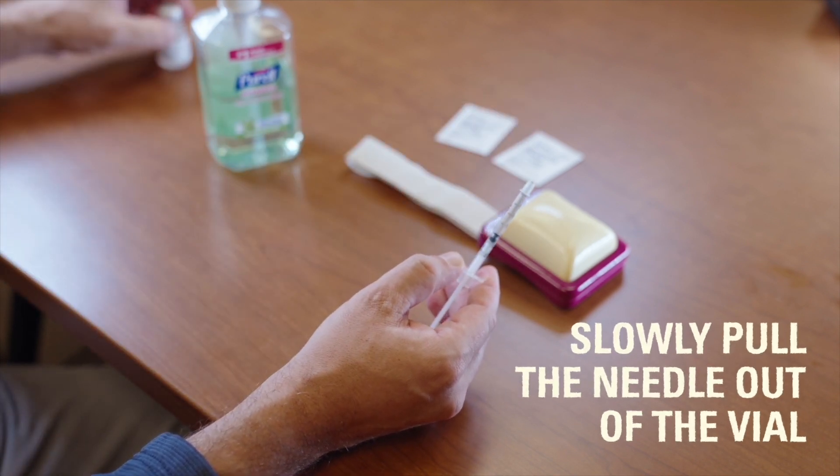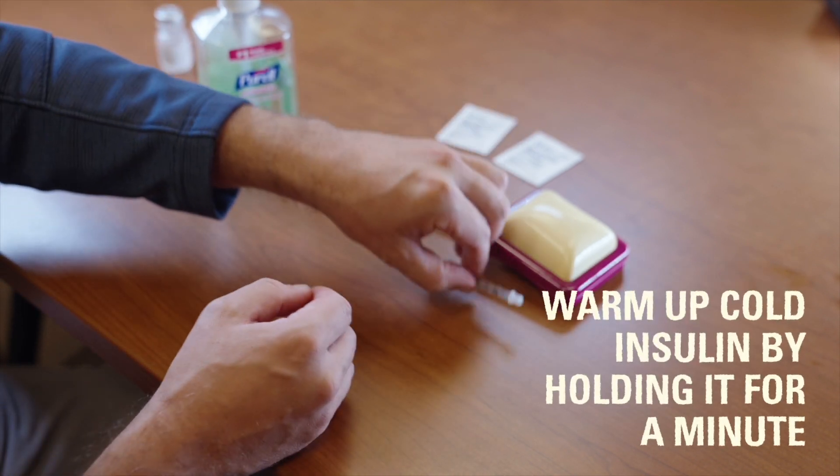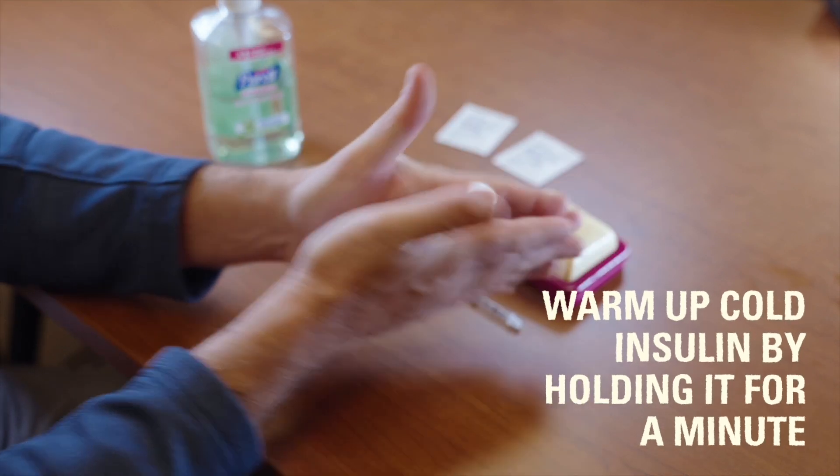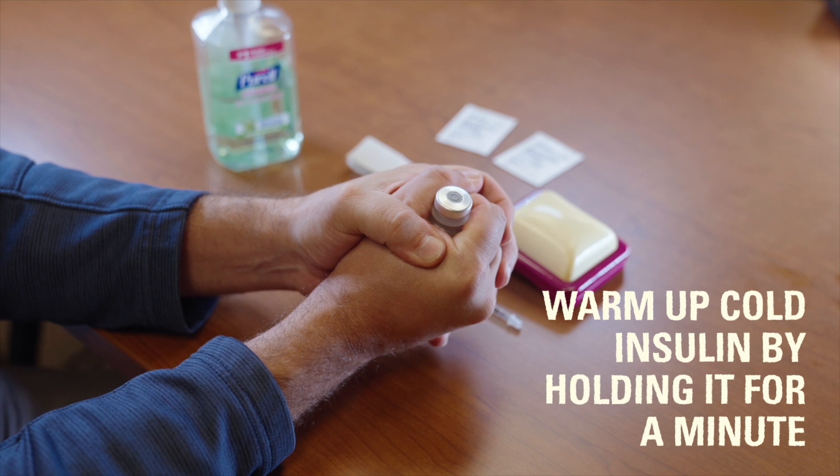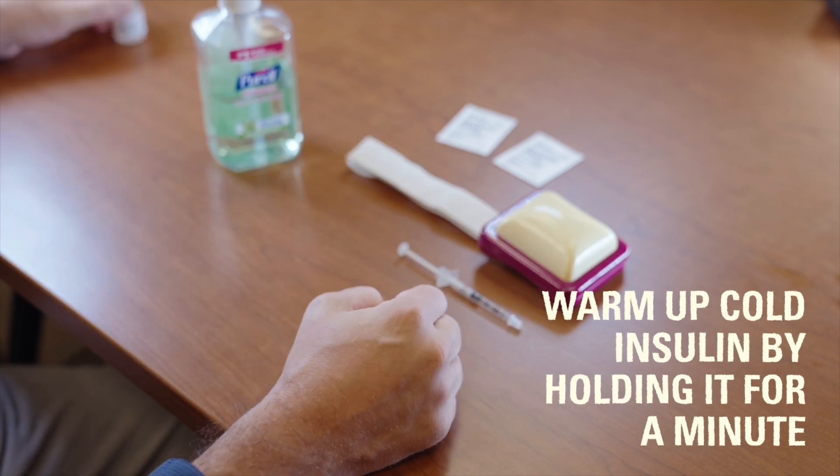If the insulin has been stored in the refrigerator recently, you can warm the vial up by holding it in your closed fist for a minute or so. This will help reduce the sting that children may feel when cold insulin is injected.